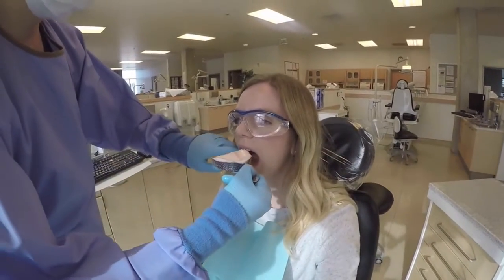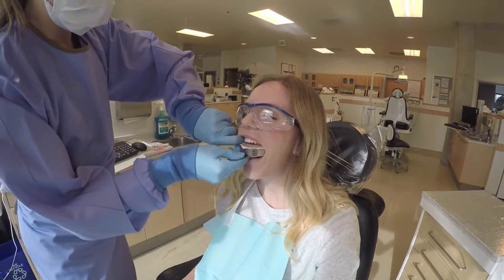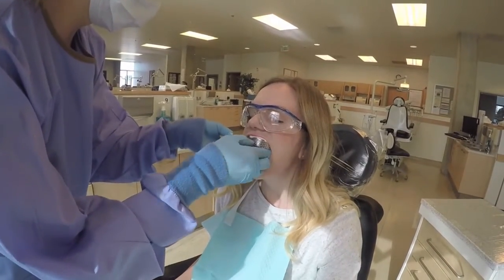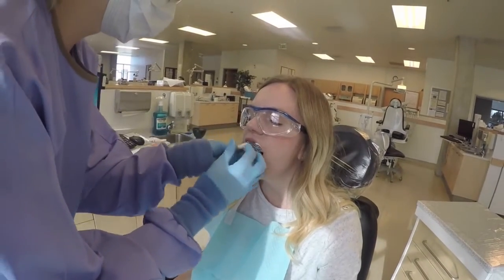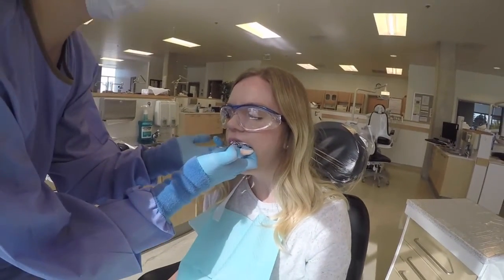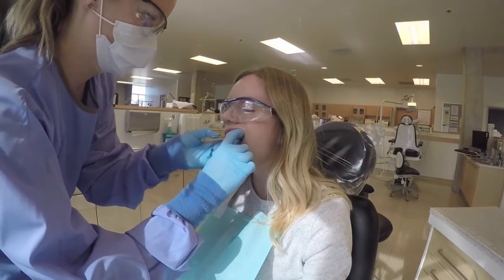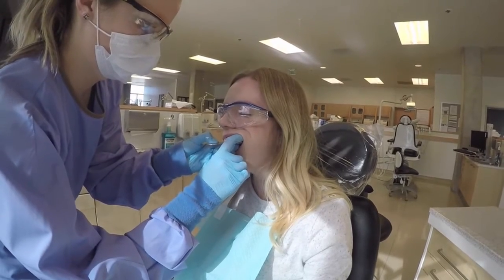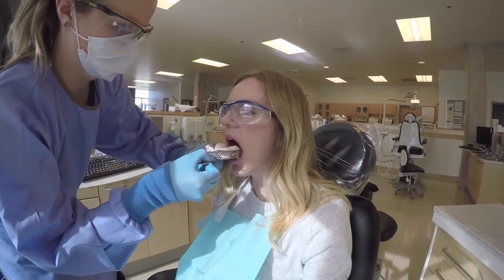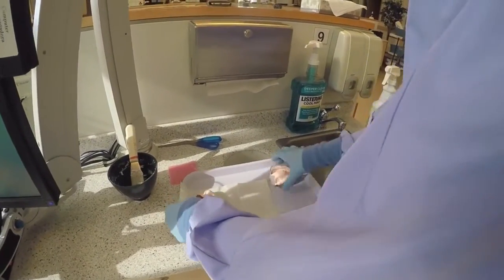Insert the tray into the patient's mouth the same way you did for the opposite arch. Ending with pulling the lips over the tray. Once the material has set, use one finger to hook under one side of the tray and pull away from the arch to release suction. You can then remove the tray from the patient's mouth by turning the tray sideways as you pull the tray out. You will now sterilize the impressions before taking them to the lab.